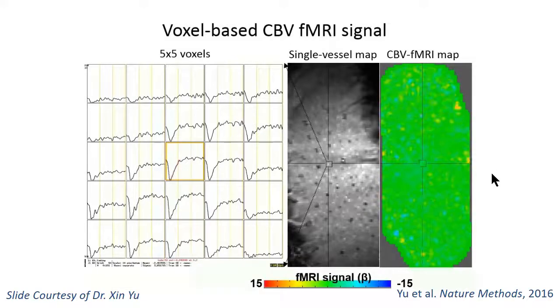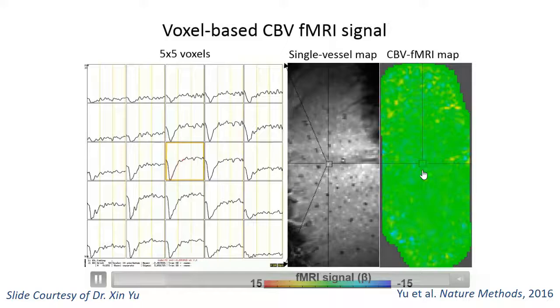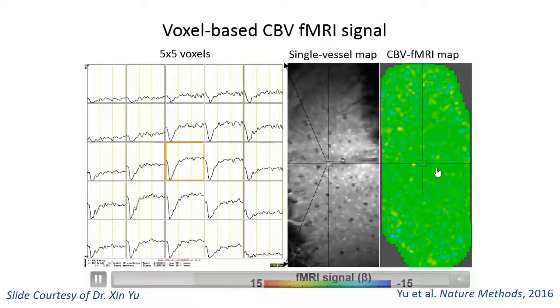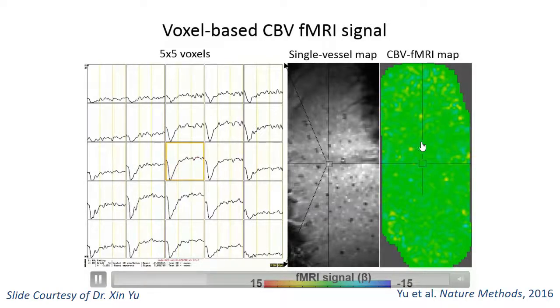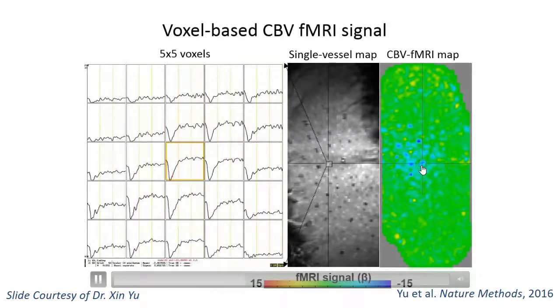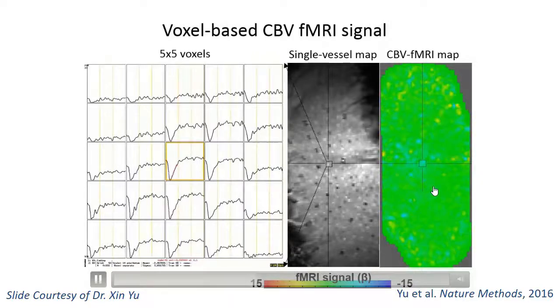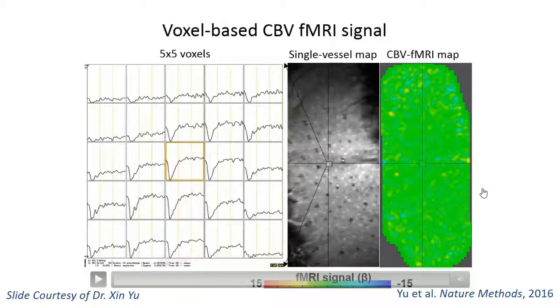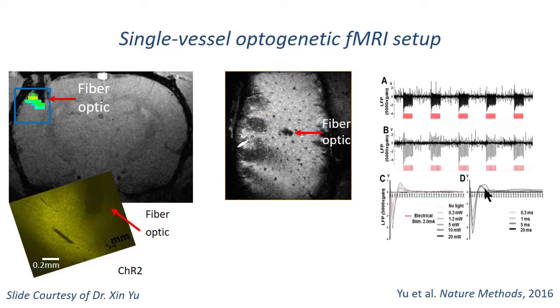intravascular tracer for blood volume maps, and in this case, the voxel now is on an arteriole, so I'm letting it loop again so that the stimulation starts, and once it starts, we're going to see again activation of the capillary bed and then the arteriole here, indicating that you have the capillaries, which are the blood vessels closest to the neurons, initiating the hemodynamic response in that functional area. So this can be done in combination with optogenetics.